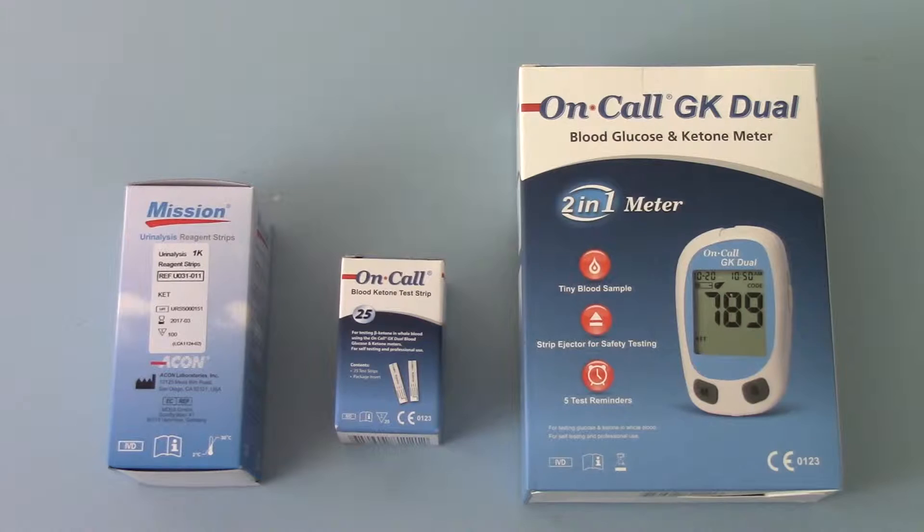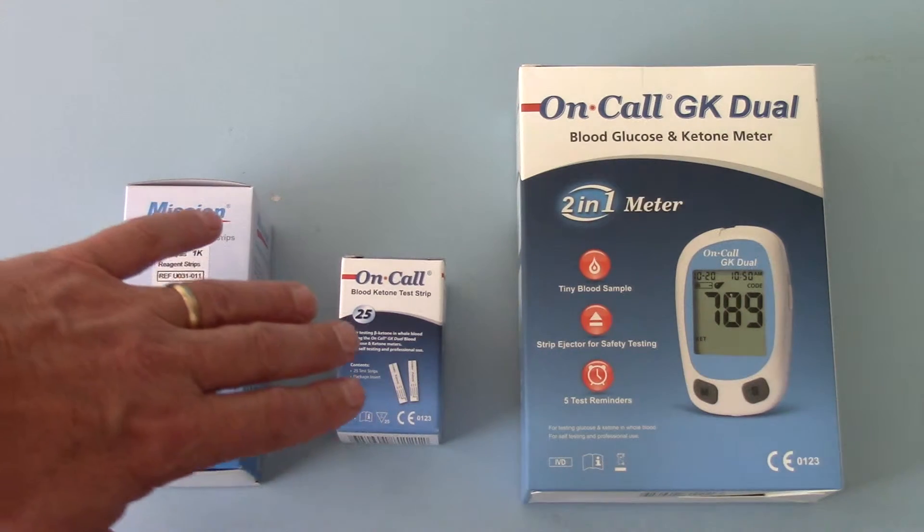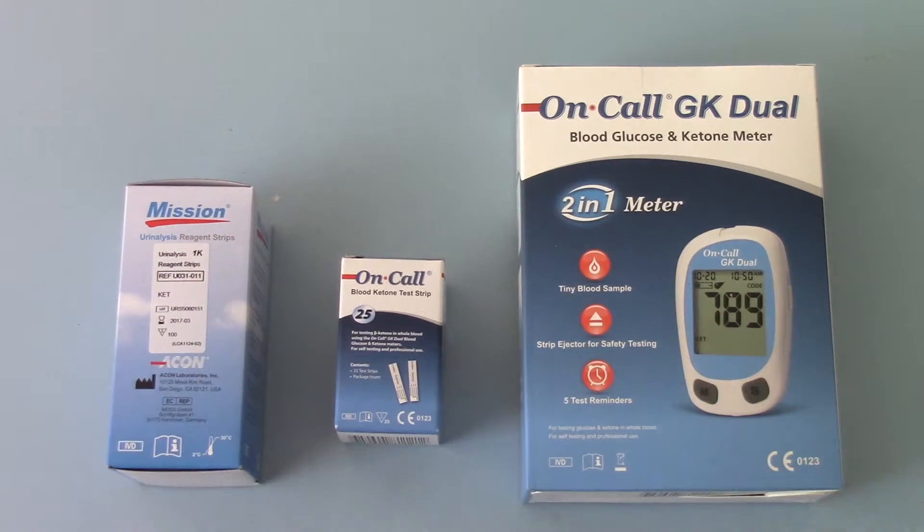The only accurate way of doing this directly is by the use of a blood meter such as the on-call dual GK meter shown to you on the right hand side here, with the combined use of the on-call blood ketone test strips. This gives you a direct measurement of the blood ketone level at the point of testing. It's going to be more accurate than using a urine dip test but it is invasive and requires a finger prick of blood.